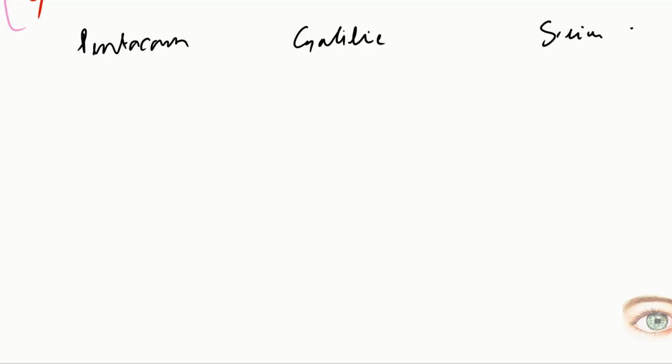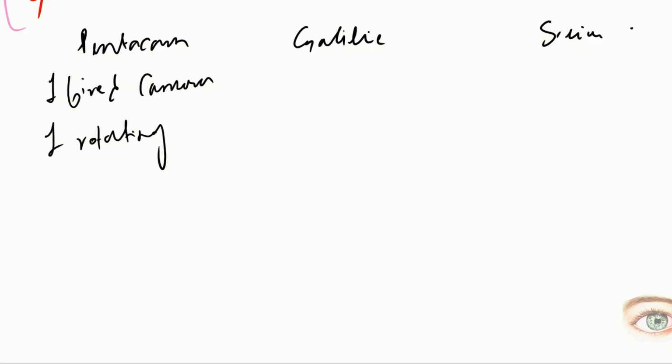Now, what happens in the Pentacam? In the Pentacam, we have one fixed camera and one rotating camera. Also, there is no Placido disc in the Pentacam.